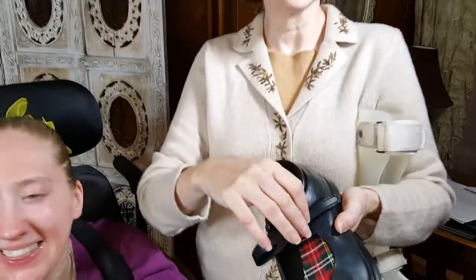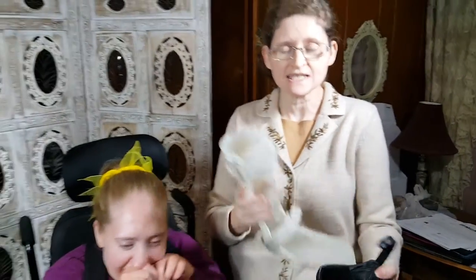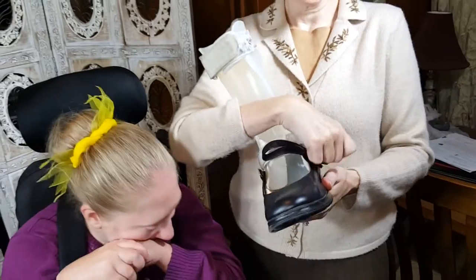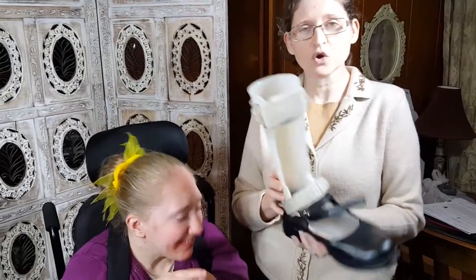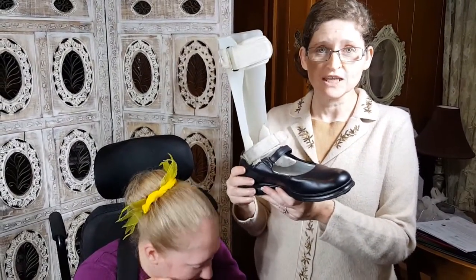Now she has a new pair of Mary Janes. I always get the kind that velcro and not the kind that buckle, just because it's easier and it's faster. Her foot fits right into the Mary Janes shoe and it velcros right across here — this is what Micah wears every single day.